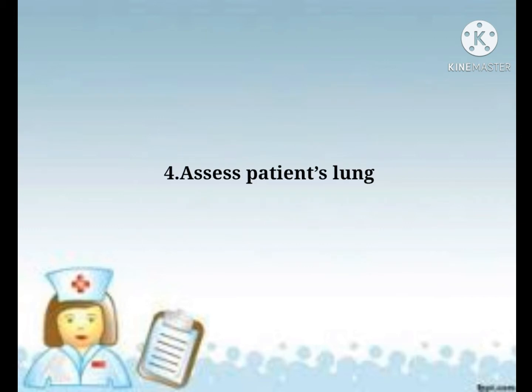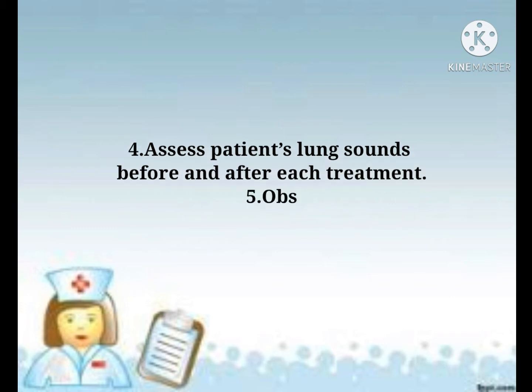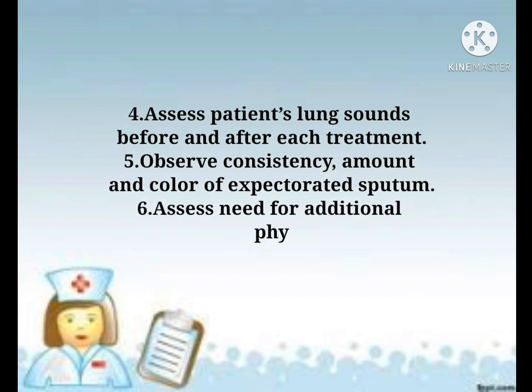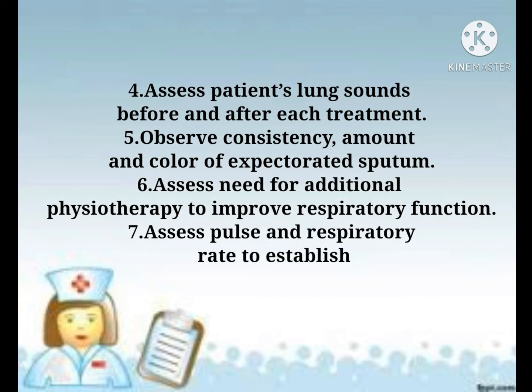Next is to assess patient's lung sounds before and after each treatment. Observe consistency, amount, and color of expectorated sputum. Assess need for additional physiotherapy to improve respiratory function. Lastly, assess pulse and respiratory rate to establish baseline data.